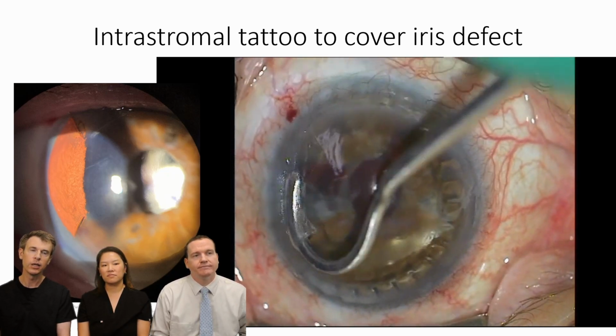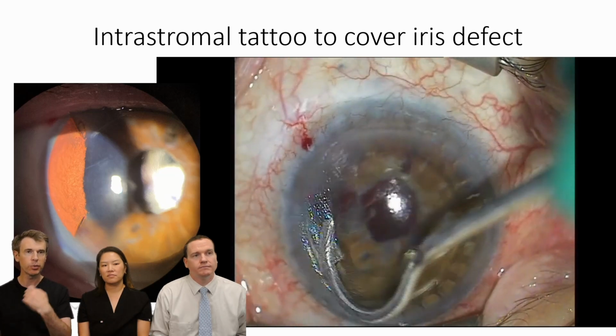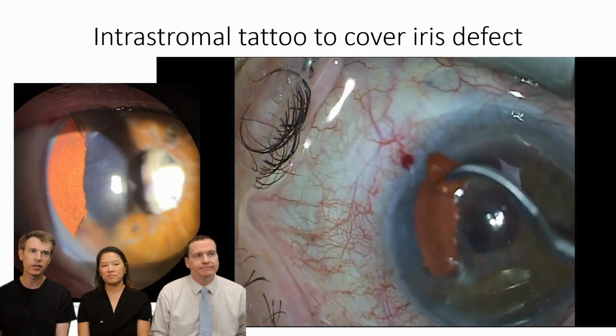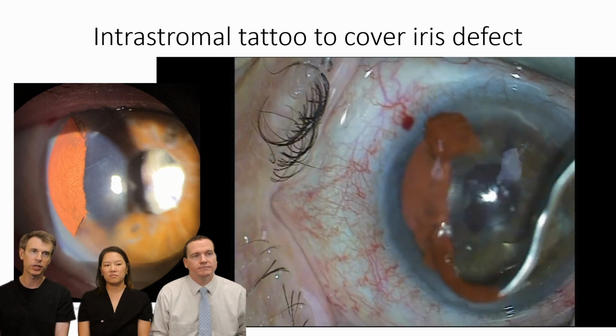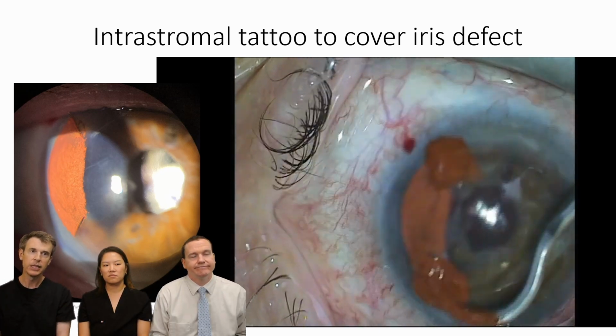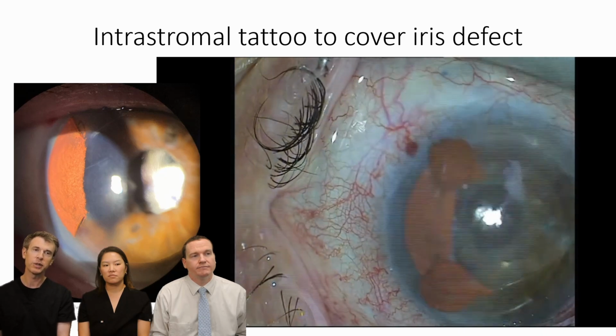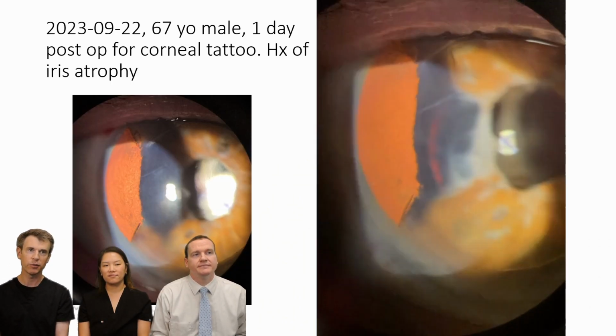forming a similar channel as you saw for the placement of the CAIRS, opening it up with a similar instrument, and then literally placing tattoo ink into that same channel. There's a lot just basically being swept in. You can also inject it with a syringe from both sides and try to make it as wide as possible. This patient also had megalocornea, which made everything more difficult, including positioning. So overall, not the most straightforward case.